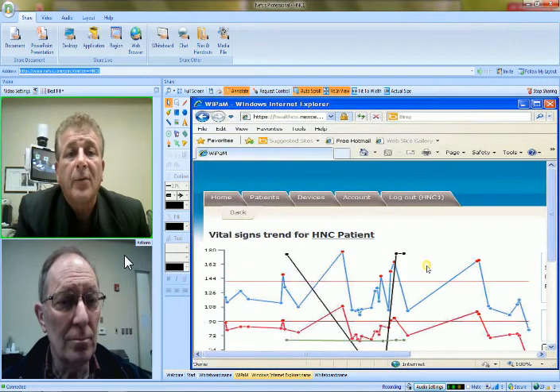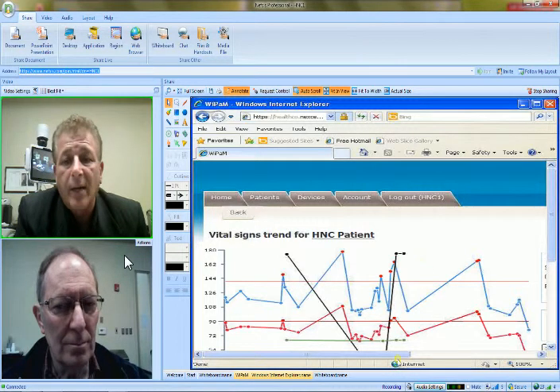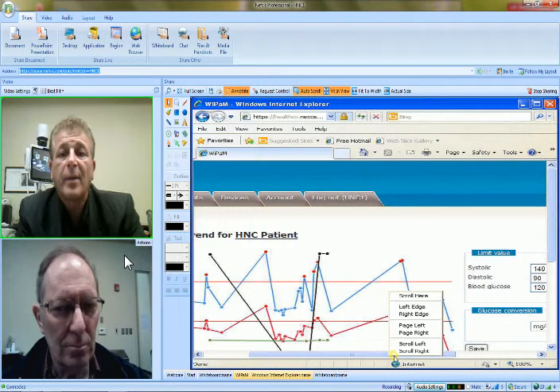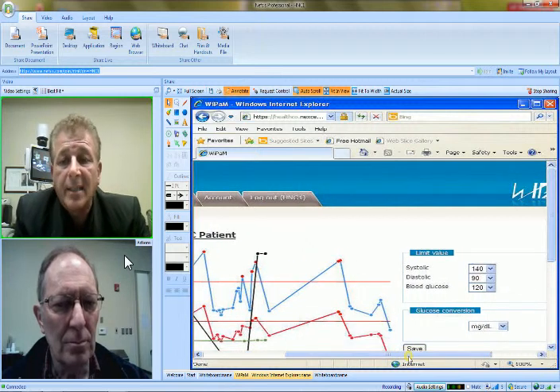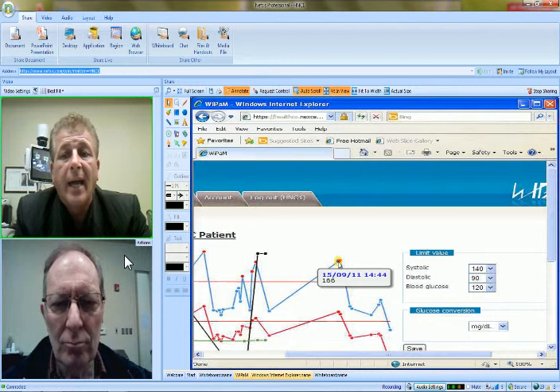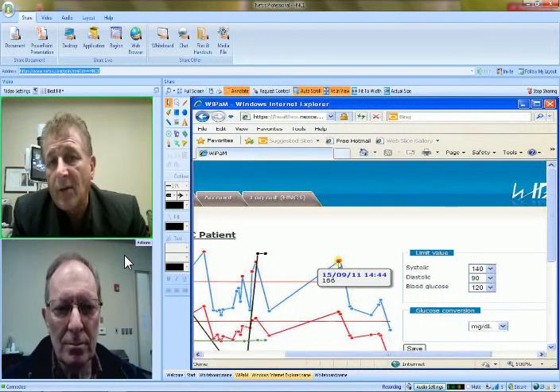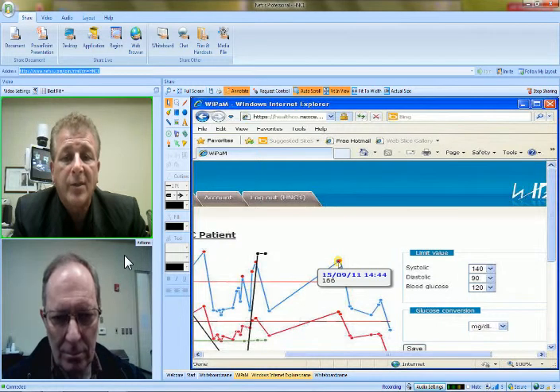So the first thing we want to do is let's look at how Bob's been doing. And you'll see on the right-hand side of the screen charts and graphs. These are things I'm going to share with my patient Bob and my colleagues, so we can all be on the same page. Now you'll notice some red dots. Those red dots basically tell us we've gone beyond limits that we wanted to. For Bob, on the right-hand side, you see I've set his limit values at 140 for systolic, 90 for diastolic, 120 for glucose. So if any of those readings are higher than the numbers I set for Bob, it gives me a red flag, and those are the red dots you see.